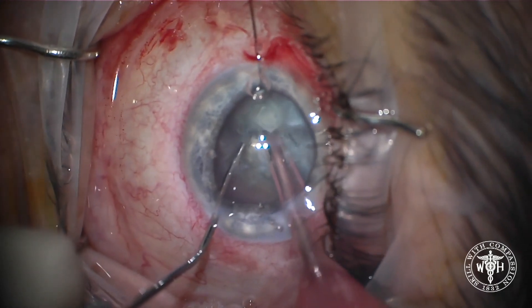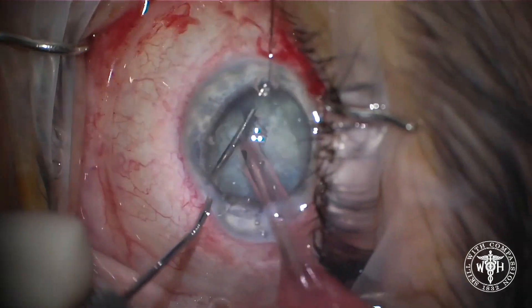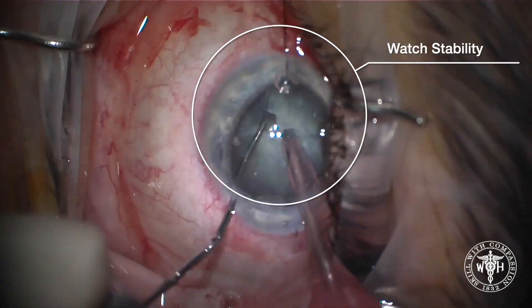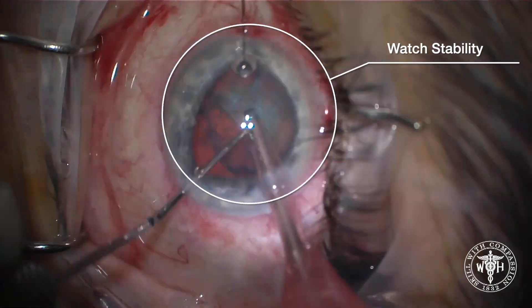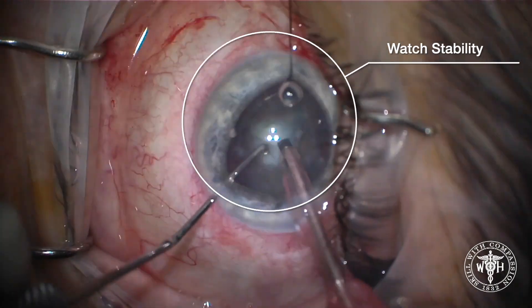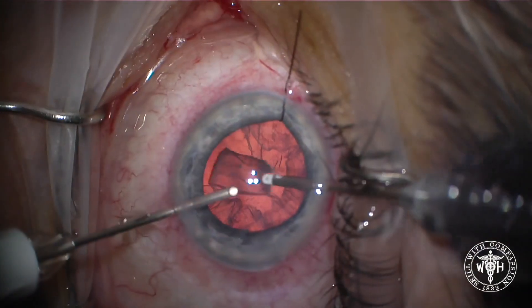I haven't changed my fluidics, I haven't changed my technique, I haven't changed anything. And here in fast forward once again you'll now be able to see that we're not moving in and out of the focal plane. There's no more dilation of the iris and we're not moving that lens posteriorly, and the patient is now much more comfortable.